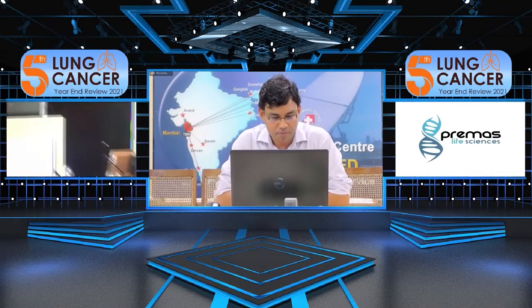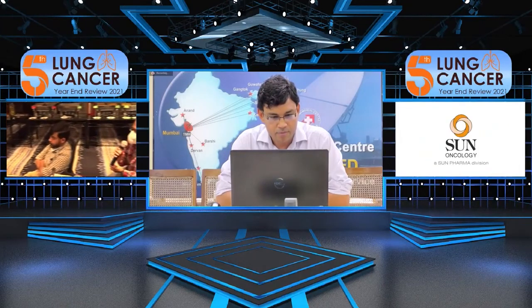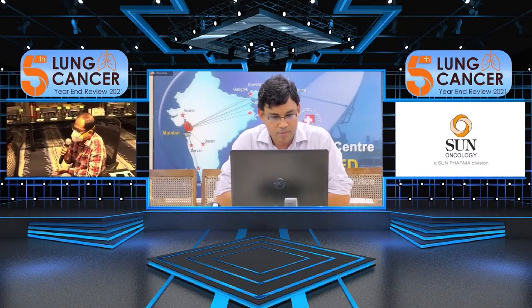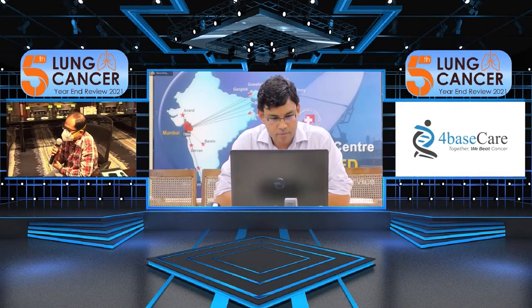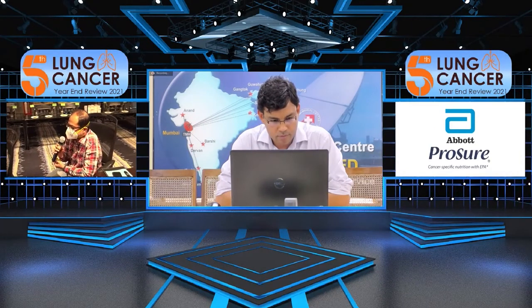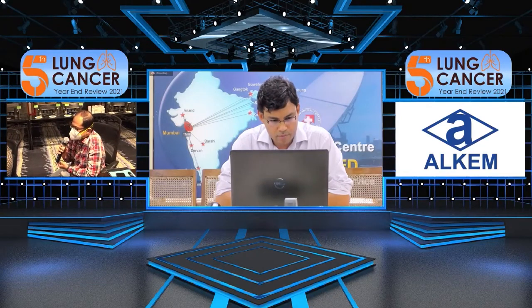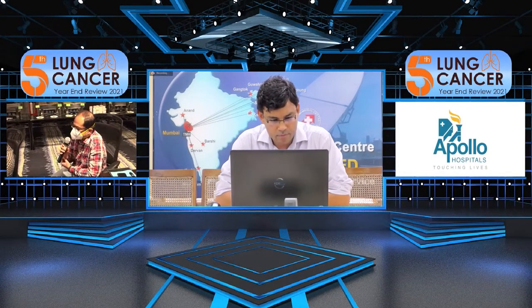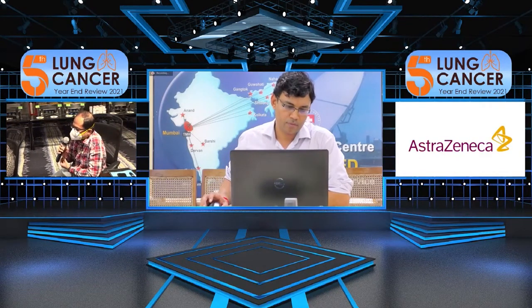Good afternoon, sir. My question is: if a patient who is suspected to have brain mets needs to undergo a contrast MRI, and the patient is allergic to contrast with a previous history, or has CKD or other renal dysfunction, in such cases is it still advisable to do a contrast MRI, or will an NCCT be equally good as an MRI, sir?